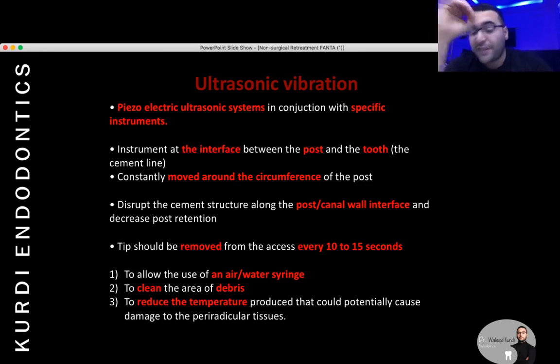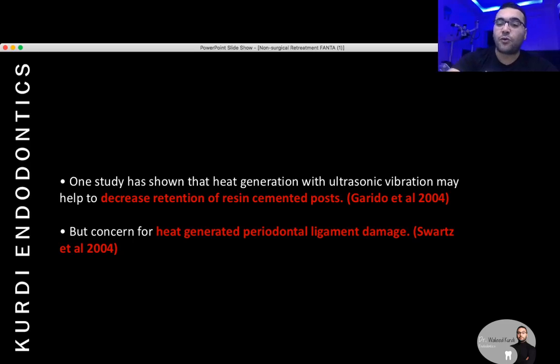Because it's very important. In an evidence-based way, I will mention that one study showed that the heat generation of the ultrasonic and the vibration will help to decrease the retention of the resin cemented post. But you should know that the heat generation can damage the periodontal ligaments.